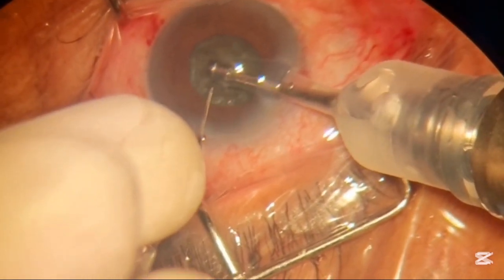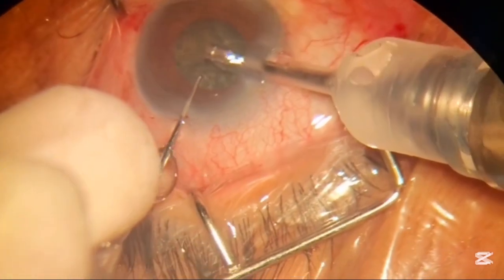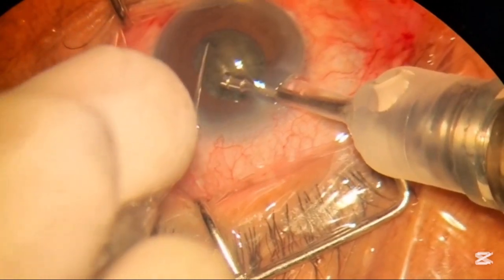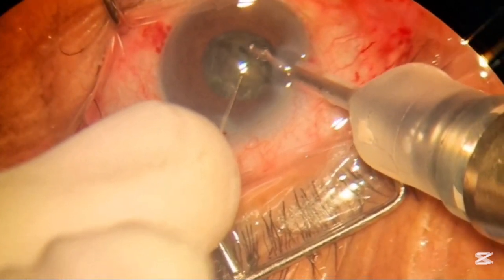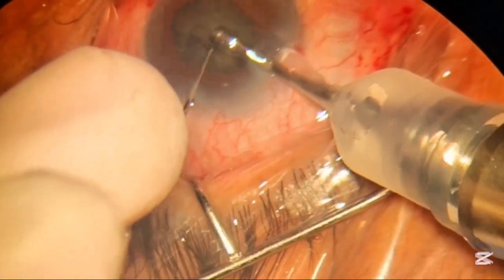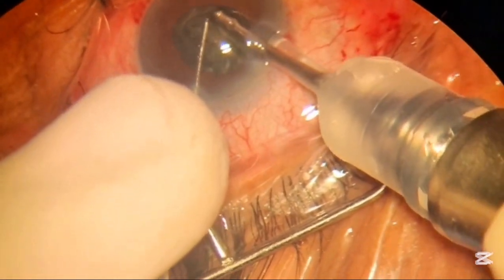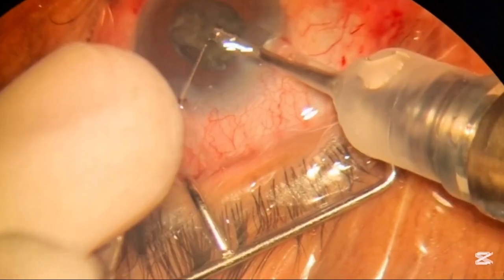Now we are done with two cracks and we will create a space by removing a small piece from the bag. After removing the piece from the bag we again make another cut or break to create another piece to be chopped. Now after creating such small pieces into the capsular bag, we will start removing these pieces one by one.